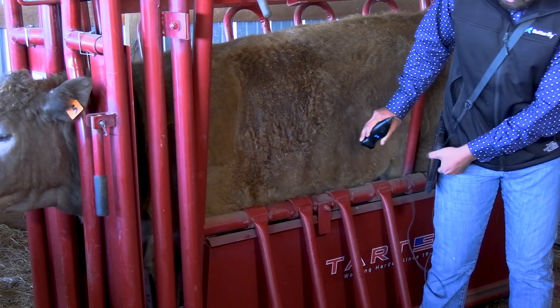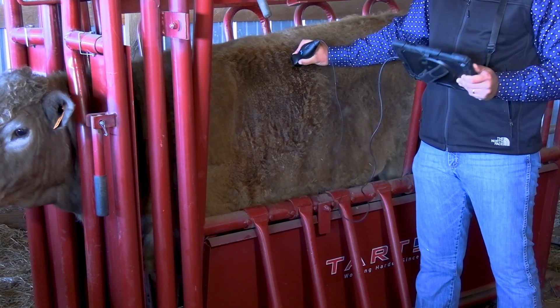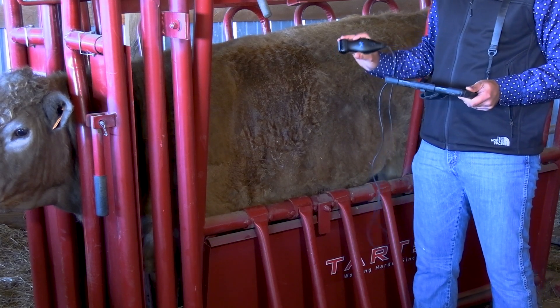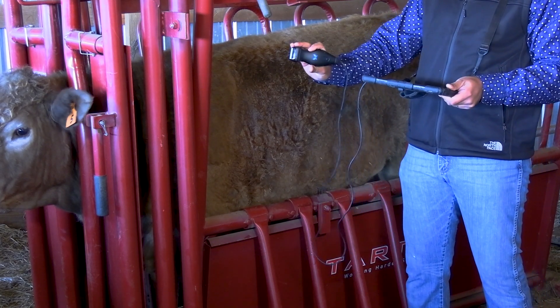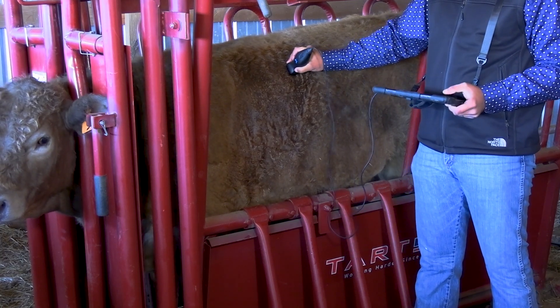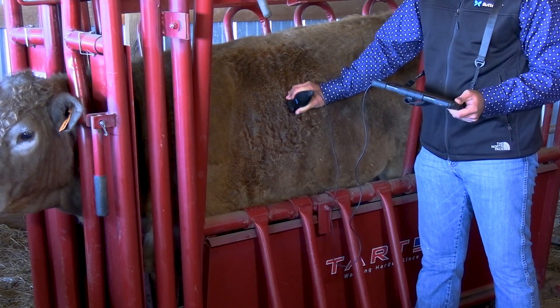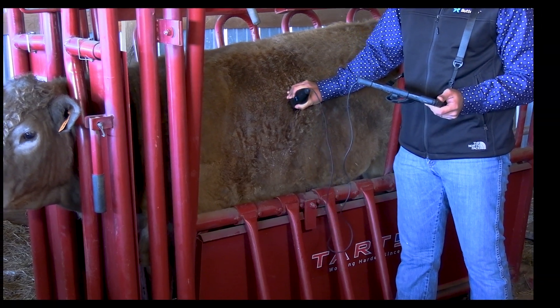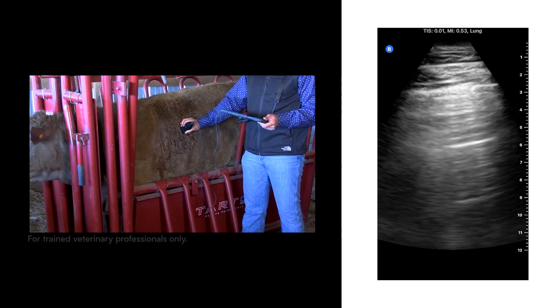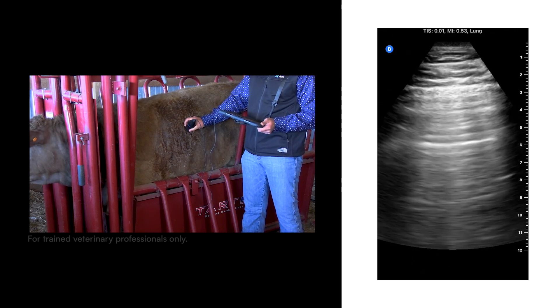It is also important to note that if the animal has a pretty distended rumen, things are going to be pushed a little bit cranially, so you might have to skip to the next intercostal space and again go dorsally. Make sure you're giving enough time for at least one or two respiratory movements so you can see pleural sliding.